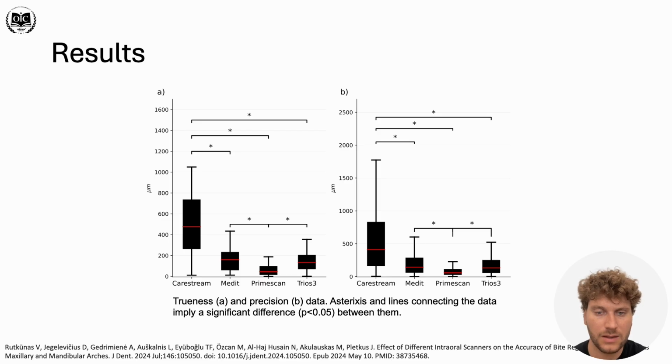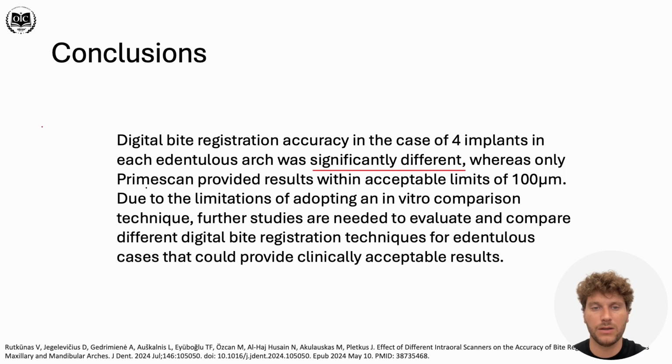So we should take that with a pinch of salt when comparing Carestream to other scanners in this environment. Although we concluded that there was a statistically significant difference in terms of precision and trueness, only the Primescan presented results in the realm of 100 microns. This is the threshold that is cited in the publications, which is clinically acceptable and can be tolerated.